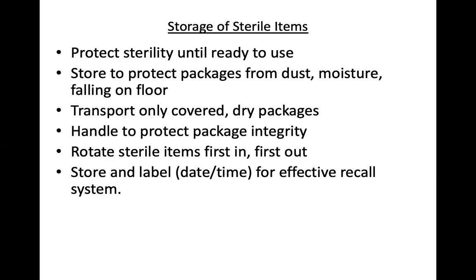Once you have done your sterilization, remember storage is very, very important. Protect sterility until ready to use. Otherwise, if you store them poorly, then by the time you need to use them, they will be contaminated. Keep them covered well, protect them from dust and moisture, keep them on shelves where they are not falling on the floor, and make sure you can protect the package integrity.